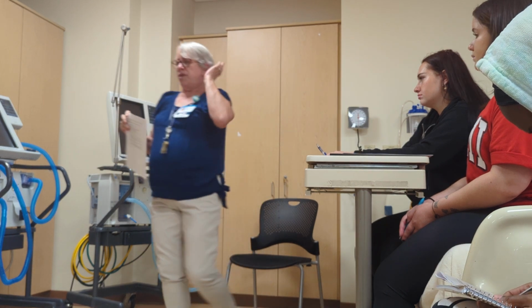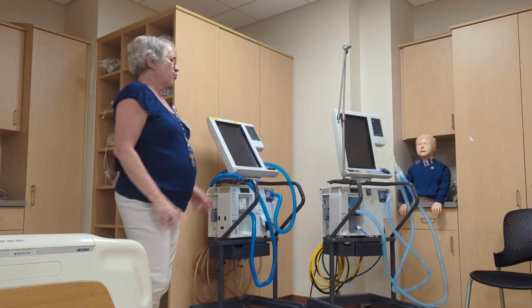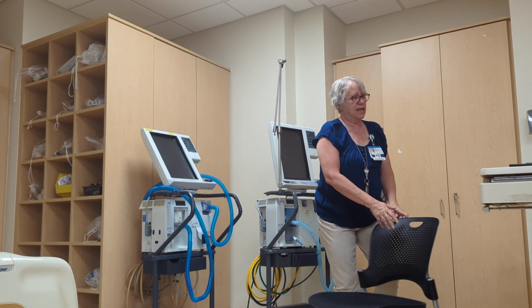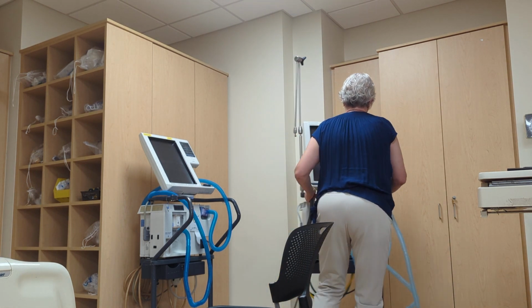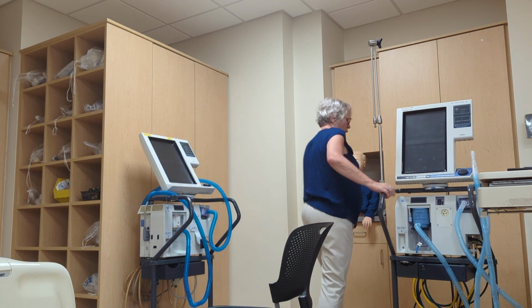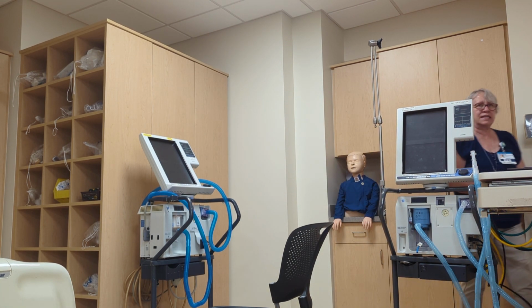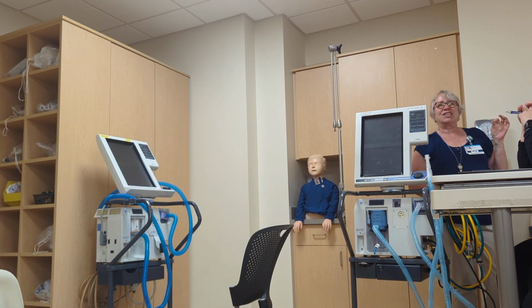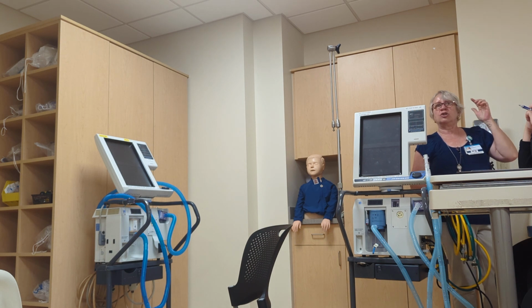All right, before you put a patient on a ventilator, you have to run tests on it. And I have EST and SST listed. We're not gonna run ESTs and SSTs in this lab because I don't have enough pressure generated to do them.